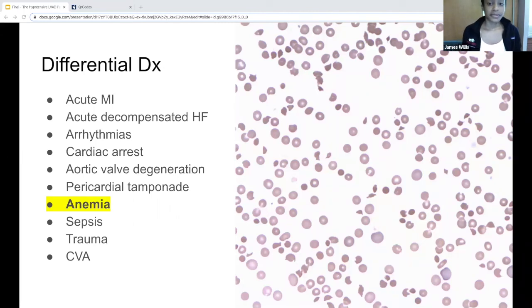The incidence of hemorrhage is high in these patients, especially in the GI tract. They're on lifelong anticoagulation. They also have an acquired von Willebrand factor deficiency that contributes to bleeding risk. The shear stress from the continuous flow of the device is thought to alter the von Willebrand factor multimers, so they're more prone to cleavage by the ADAMTS13 enzyme, and so they don't bind platelets as well.